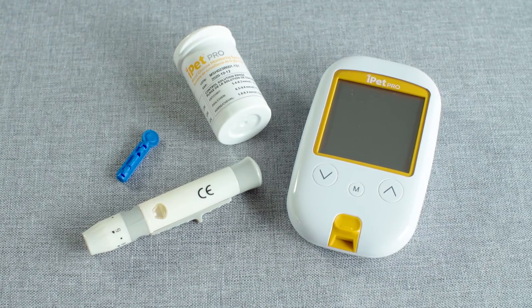If the results are not within the proper range, please refer to the user guide. You are now ready to begin the blood glucose test.